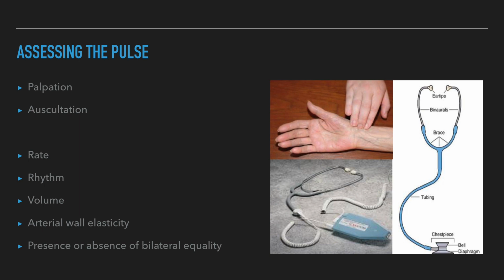Doppler. Peripheral pulses that cannot be detected by palpation may be assessed with an ultrasonic Doppler device. A conductive gel is first applied to the skin to reduce resistance to sound transmission. The transmitter of the device is then placed over the artery to be assessed. High-frequency waves directed at the artery from the transmitter are disturbed by the pulsating flow of blood and are reflected back to the ultrasound device. The sound disturbances, Doppler shifts, are amplified and heard through earpieces or a speaker attached to the device.